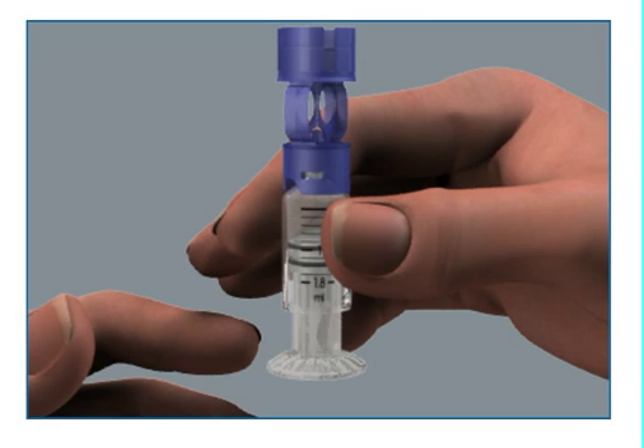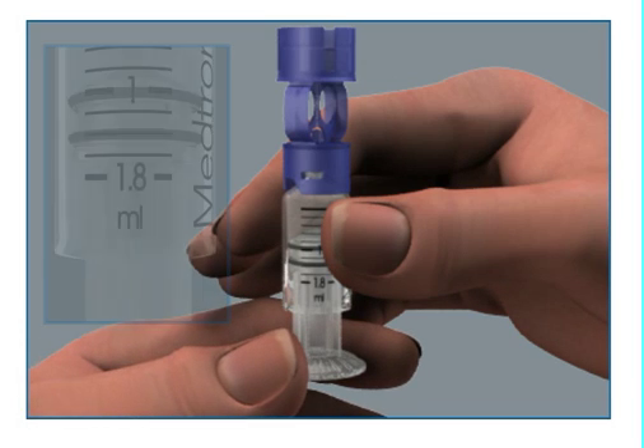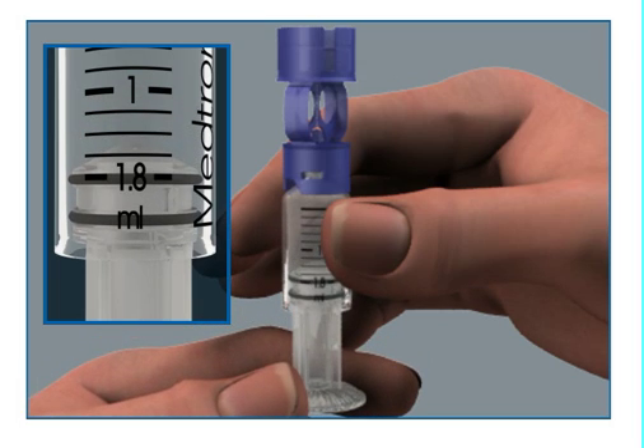Next, pull the plunger so that the top o-ring is positioned at the amount that you plan to use to fill the reservoir. Be careful not to pull the plunger completely out of the reservoir.